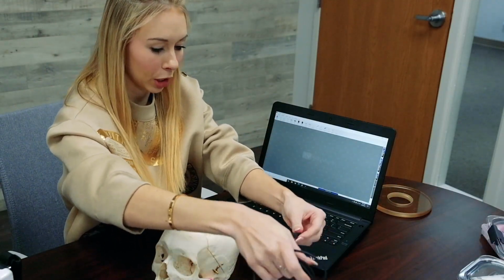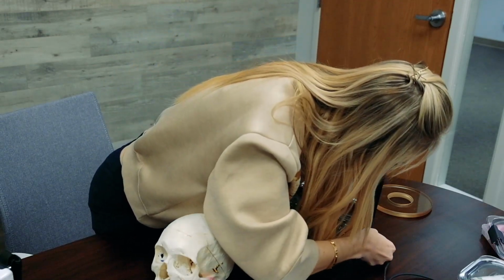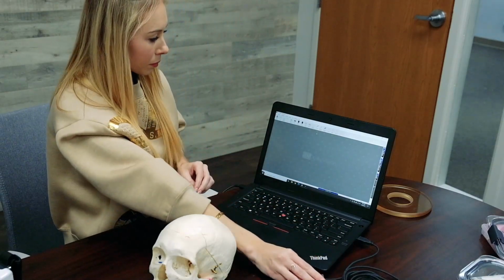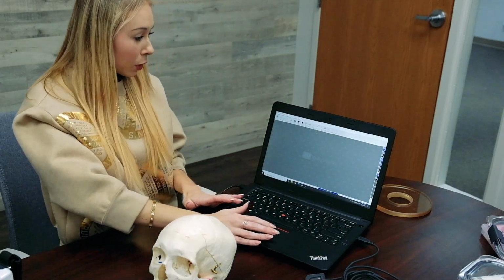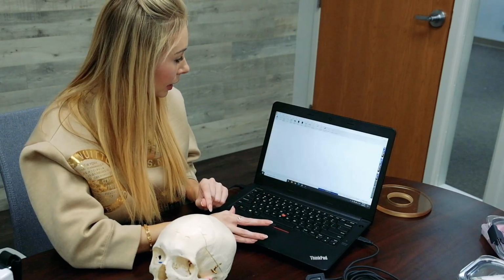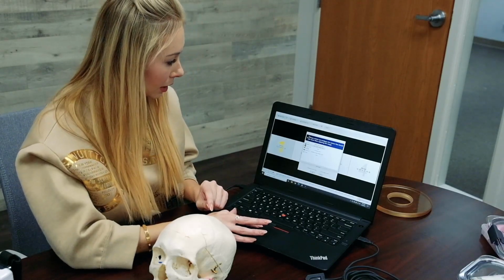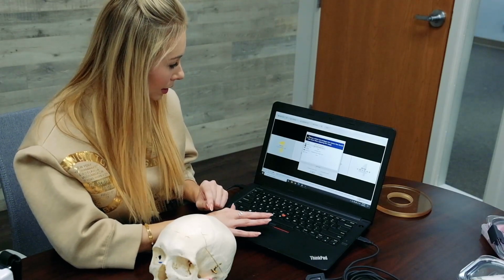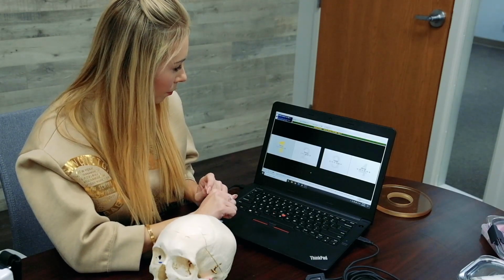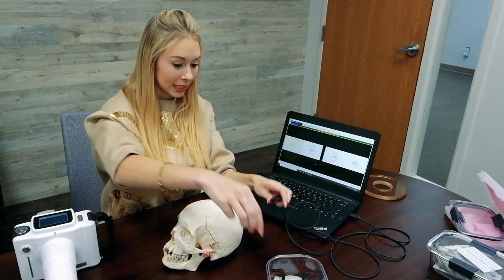Now I'm going to go ahead and plug in the digital x-ray sensor. To go ahead for Mr. Ed Bones for bite wings, all you're simply going to do is hit one button in Aptrix, and it automatically opens up the layout form for him to get his bite wing series. We are then going to select the Aurora sensor here and then hit OK. Sensor ready.